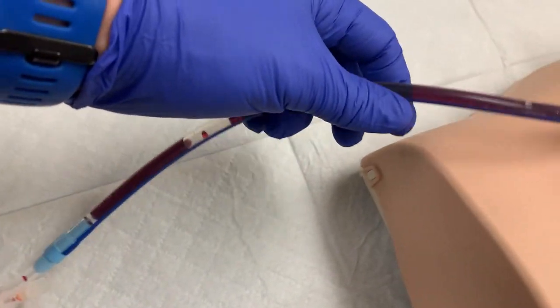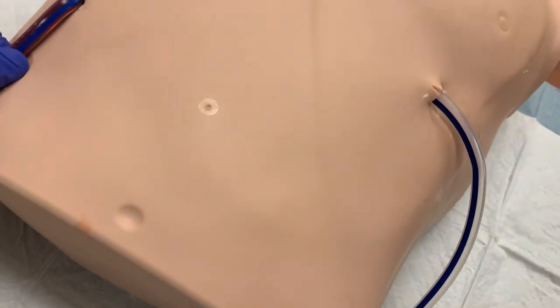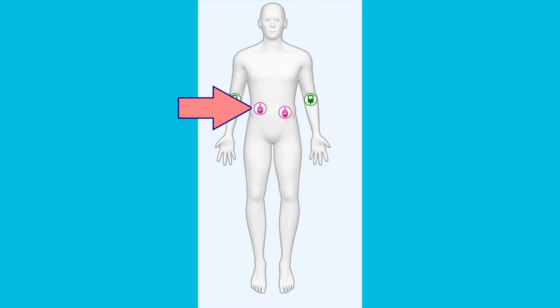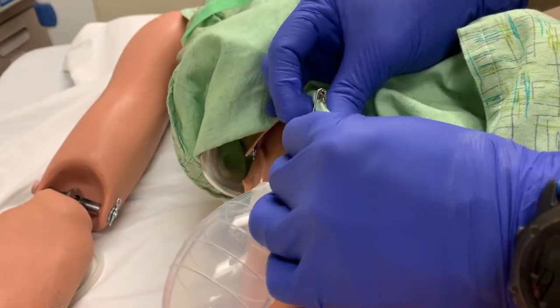When you are ready to drain the bulb, first trace the line back to the patient. Some patients will have multiple drains, and you need to know what drain you are emptying to ensure accurate documentation when finished. Assess the site for any signs of infection. Begin by detaching the bulb from the patient's gown or clothing — it should be safety pinned in place.